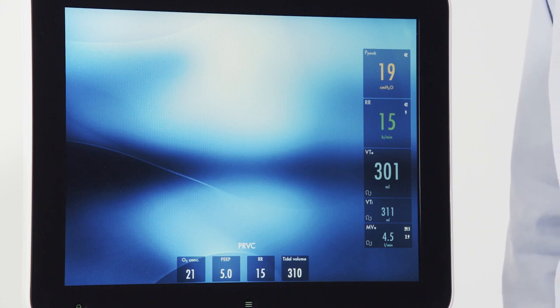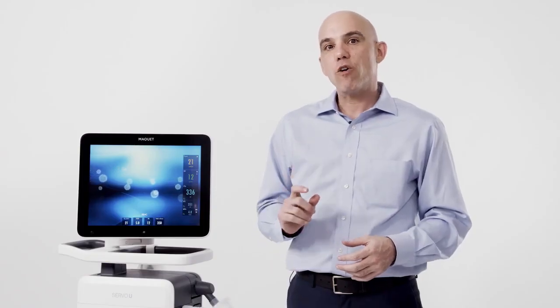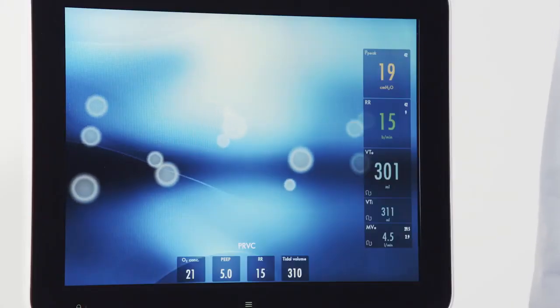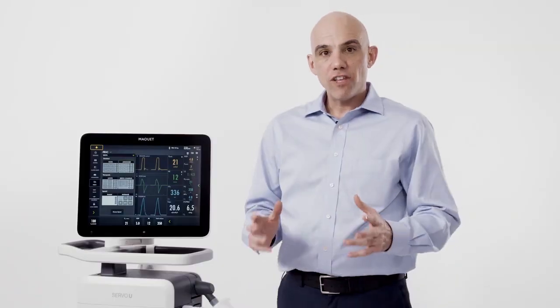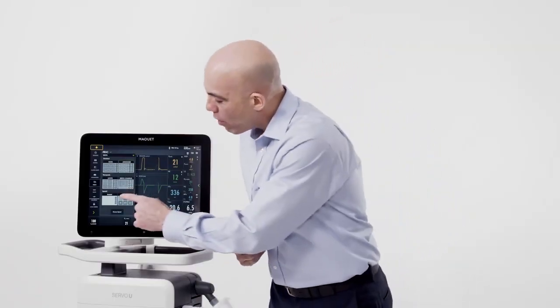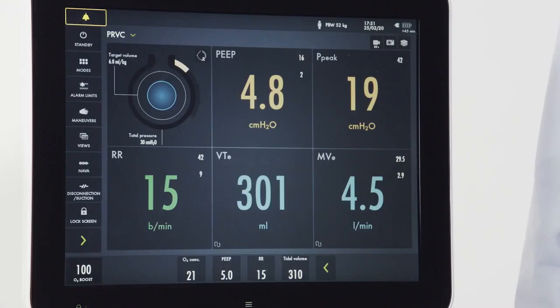Two unique views are family view and distance view. The family view can be utilized to create a more calming environment — if a more complete clinical picture is needed, merely pressing the screen will take you to your last set view. In distance view, five large numerical values are displayed, which can be very useful for patients in isolation or if a procedure is taking place in the room.